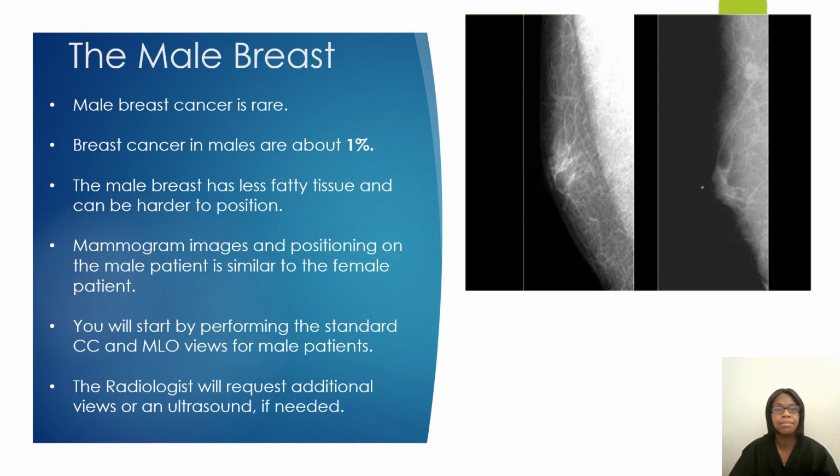Here is an image of a male breast. It is very rare, about 1% for male patients to be diagnosed with breast cancer, but male patients can be and are sometimes diagnosed with breast cancer. There are probably maybe 10 to 15 times that I have taken mammogram images on a male patient. Whenever they do come in, their mammogram images will be ordered as a diagnostic mammogram, and most of the time it may be due to pain or a lump that they are feeling around their nipple or maybe on their nipple. So the mammogram is going to be done just as if you're doing a female mammogram.